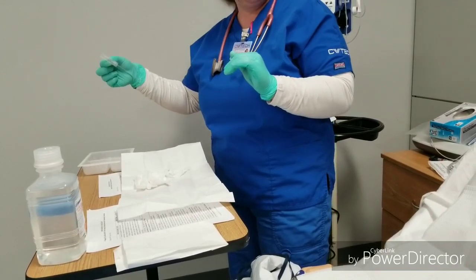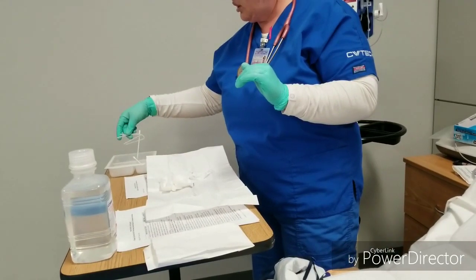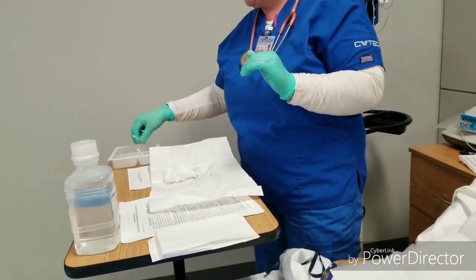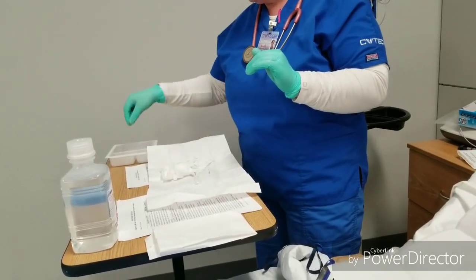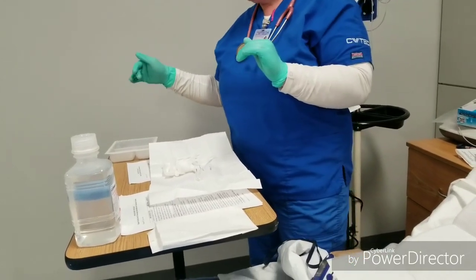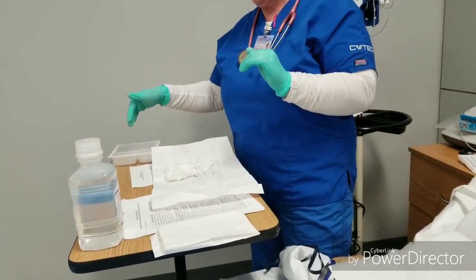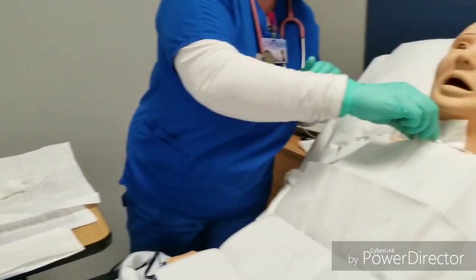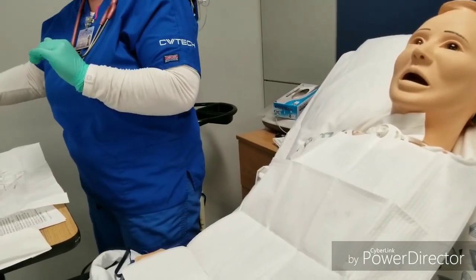This is to scrub the cannula with. These are for drying the cannula. These are for cleaning around the trach. And remember, 1 slot's going to have peroxide, 2 slots are going to have normal saline. I have put the peroxide and the normal saline in, and I'm going to take this out. I'm going to drop it in the peroxide.